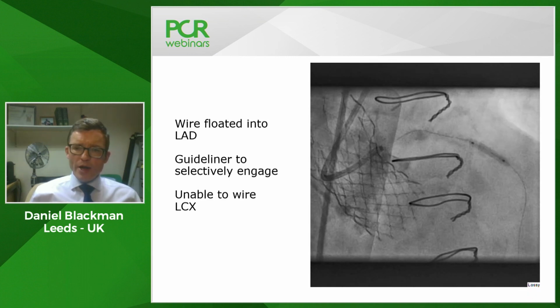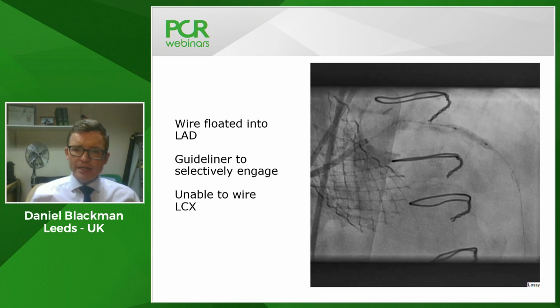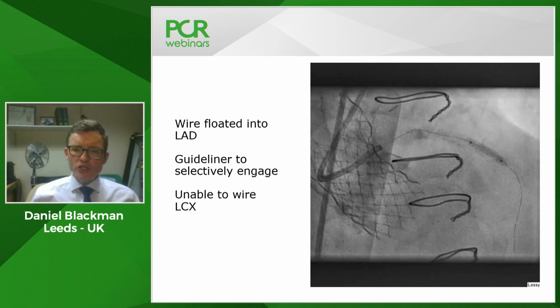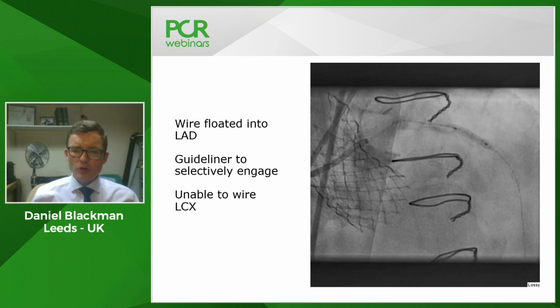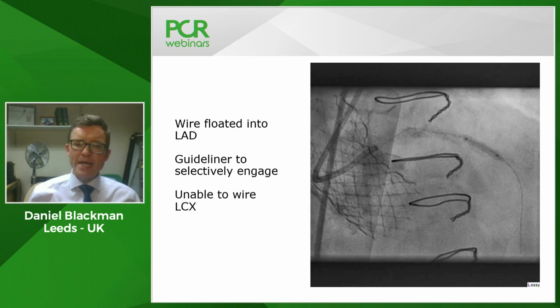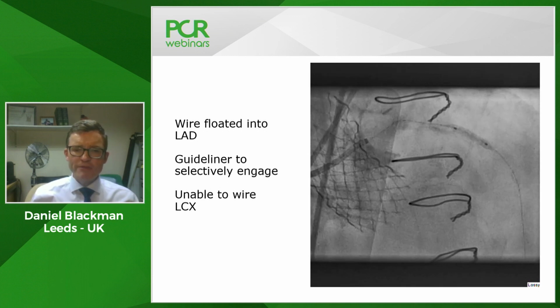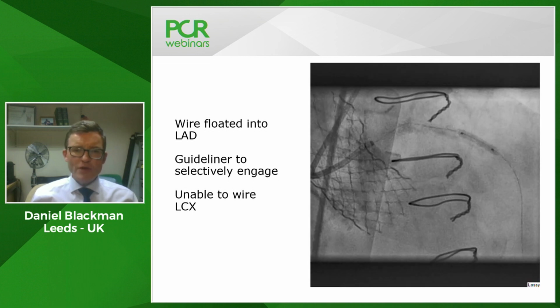So in this case, we were able to get the wire into the LAD, follow up with the guide catheter extension, which you can see at this point of the procedure is just sitting at the left mainstem ostium. And then we were able to get a balloon down into the target in the mid LAD, and that provided more support to get the guide catheter extension further in to facilitate the rest of the procedure.